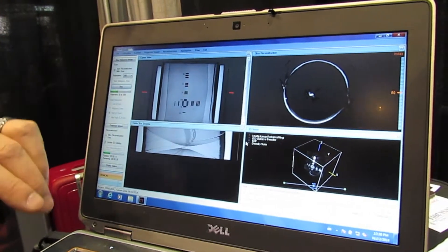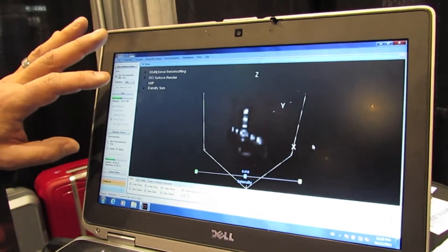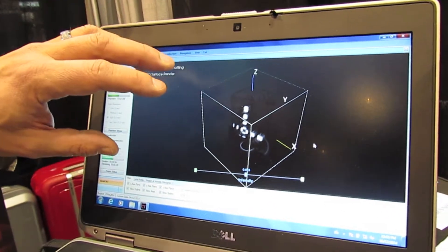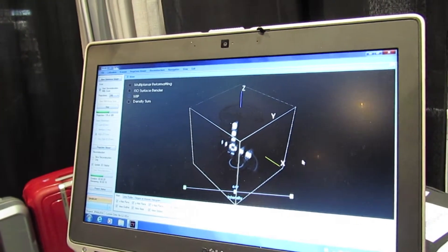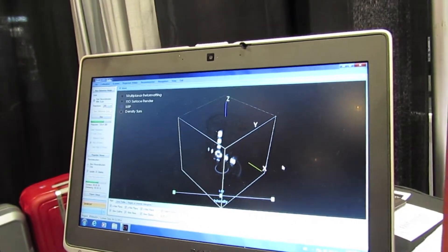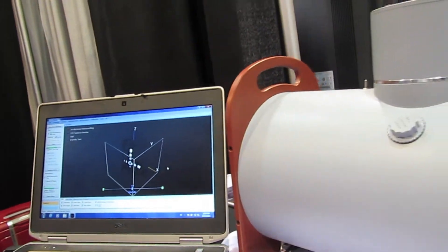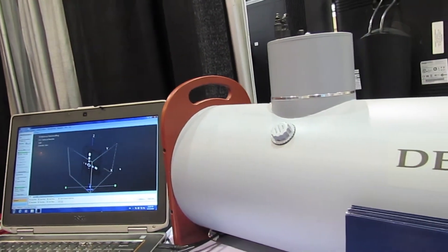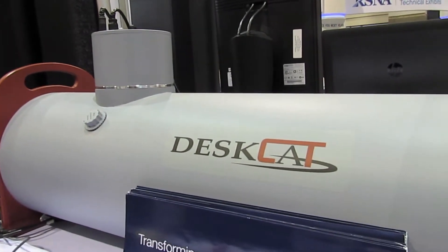This is a cone beam optical CT scanner, so in the bottom right hand corner I have the full 3D image being reconstructed in real time during the scan. This is an excellent tool to demonstrate and for students to learn how CT scanning works. The labs are very well tuned to taking the students through a series of scientific experiments and tests to really understand CT.